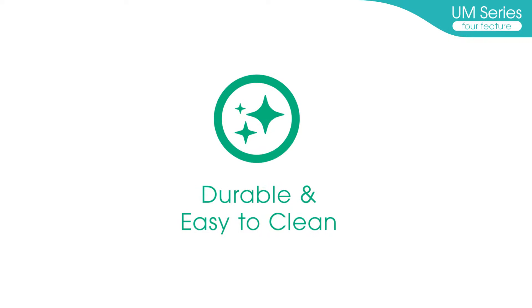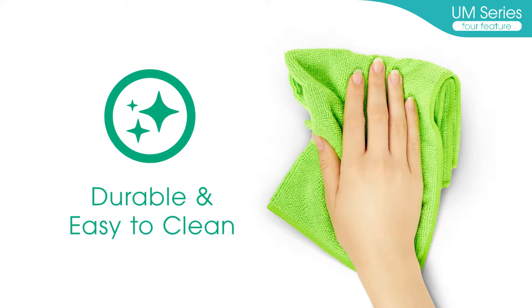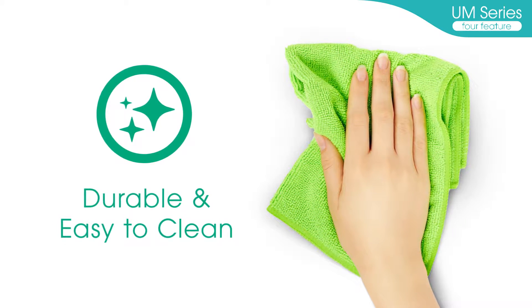Durable and easy to clean. The body and cuff of the UM-Series are chemical resistant and easy to clean with antiseptic solutions such as ethanol, ensuring hygienic use every time.